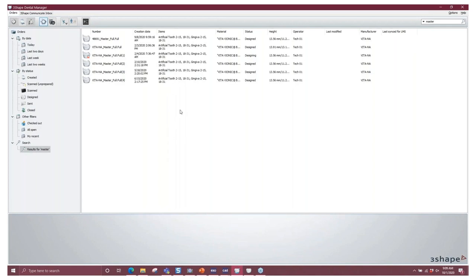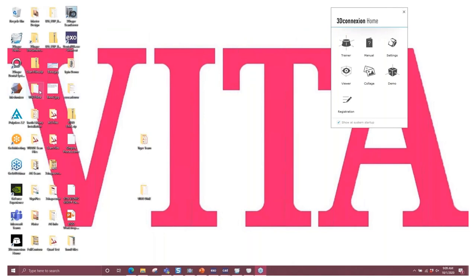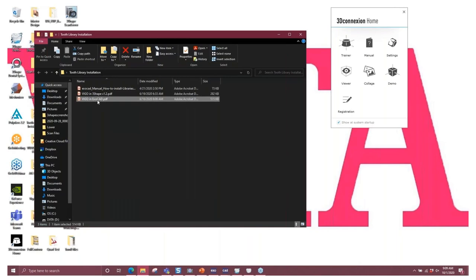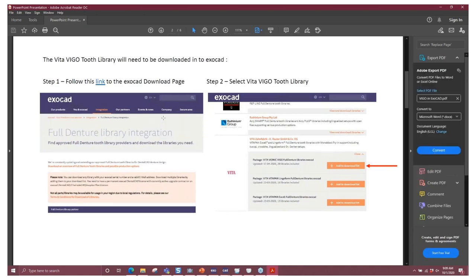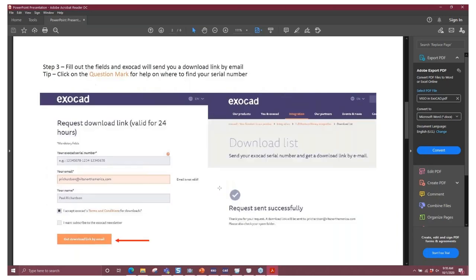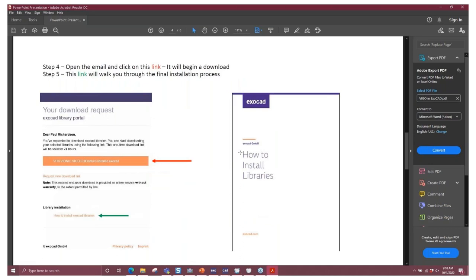Now let's look at ExoCAD. ExoCAD is a little different because you actually have to request the library from ExoCAD themselves. I can send you the link if you can't find it on their website. You're going to navigate over and select VITA VIONIC VIGO FullDenture libraries to download. They're going to ask for your serial number — the little question mark will tell you how to find it — and they will send you an email with a download link.